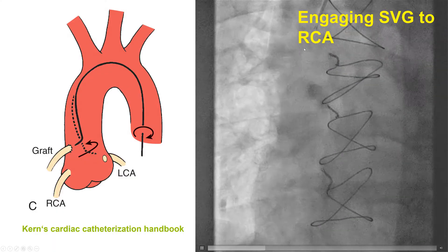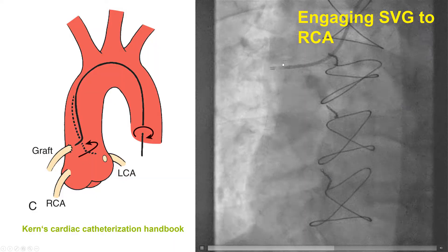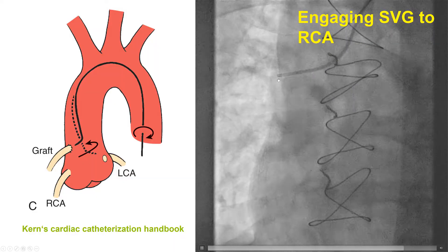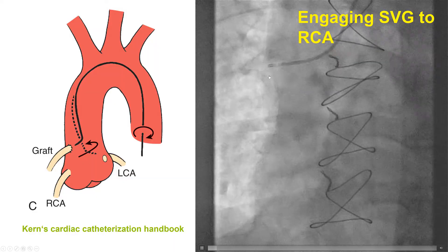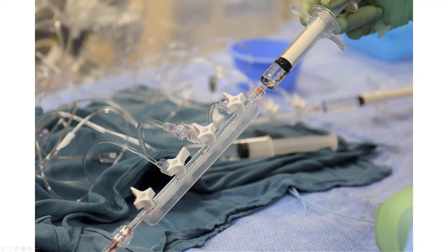This is another example — a small test injection after engaging a bypass graft to the right coronary artery. The test injection actually reveals that the bypass is occluded. Before giving an injection, it is important to hold the manifold vertical so that any potential bubbles in the contrast go to the top and do not come into the line and get injected into the coronary artery.